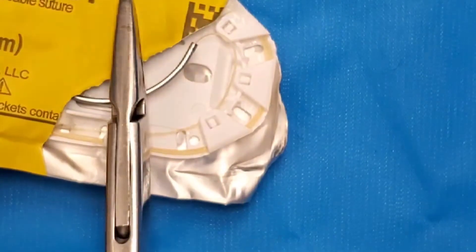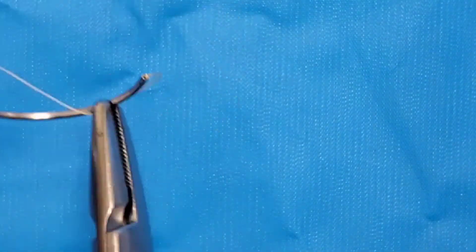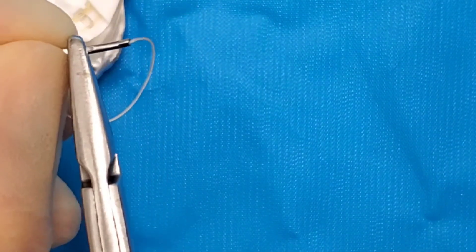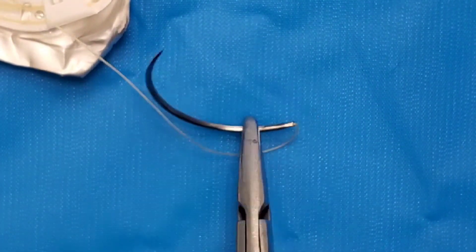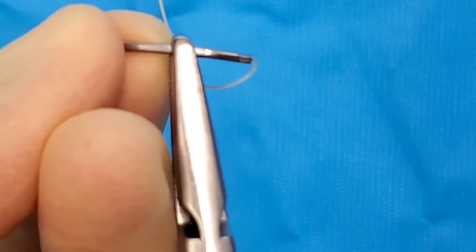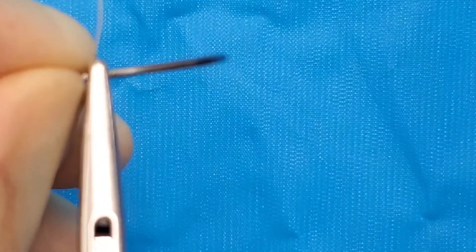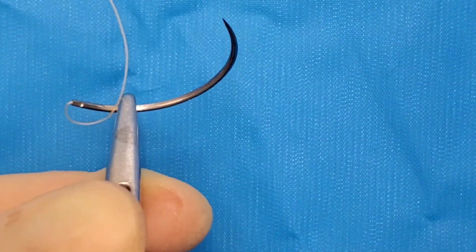Let's do it again. I have another plain gut here. Righty. Righty. Lefty. Lefty. Flip. And adjust.